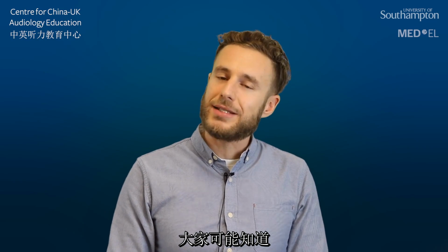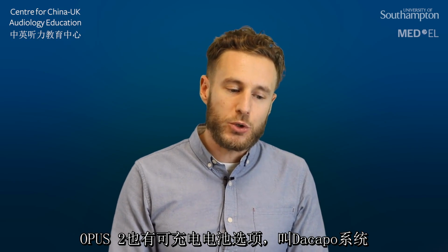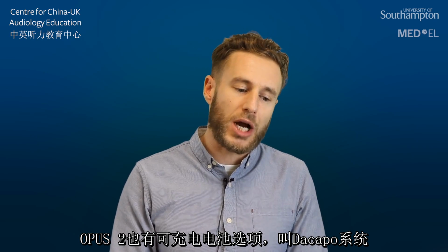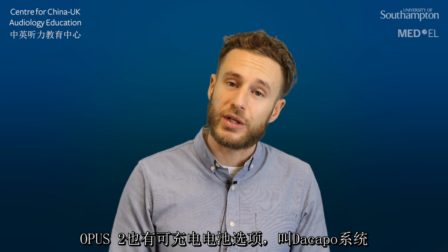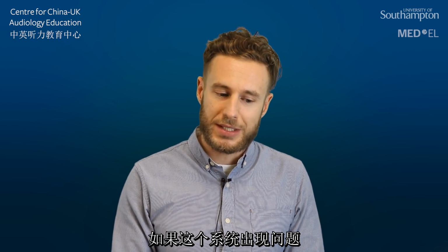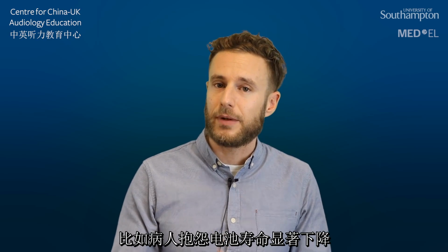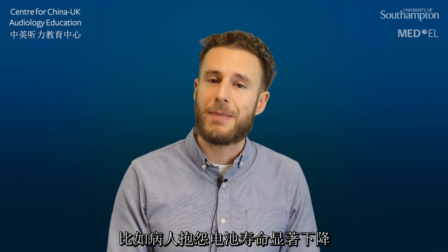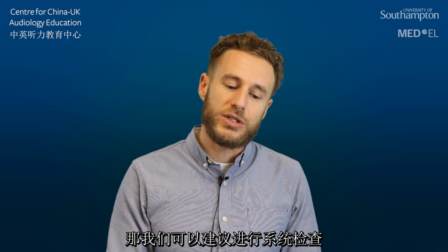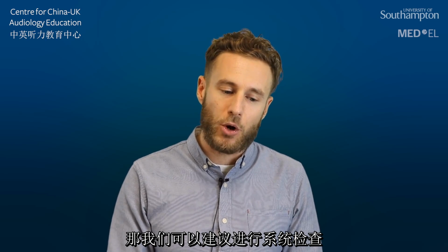Okay, so as you may already know, the Opus 2 is also available with rechargeable batteries, which is called the Da Capo system. Whenever a problem occurs with the Da Capo system, for example, if the patient reports that the battery lifetime is dramatically reduced, we would suggest this systematic approach.